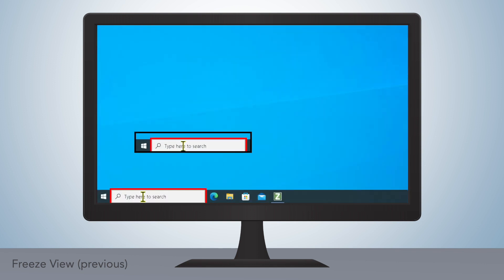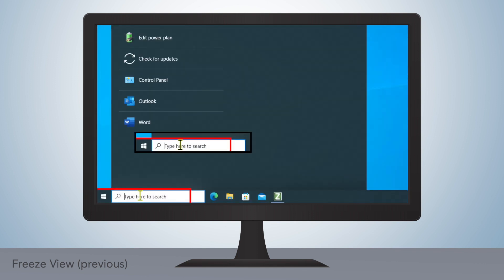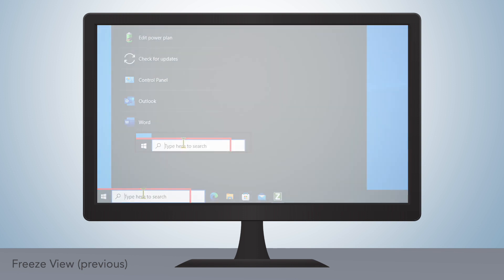FreezeView has always been a useful tool, but in ZoomText and Fusion 2023, we've expanded the capabilities of FreezeView to give users a more dynamic experience.